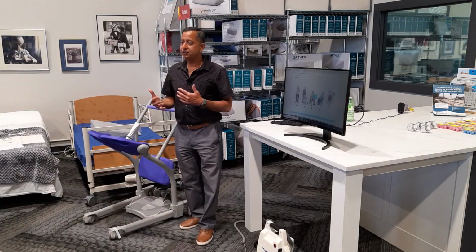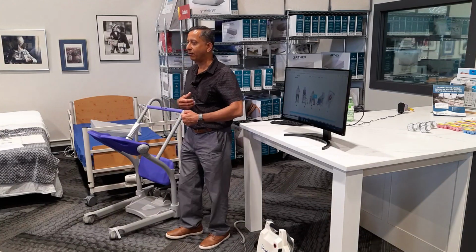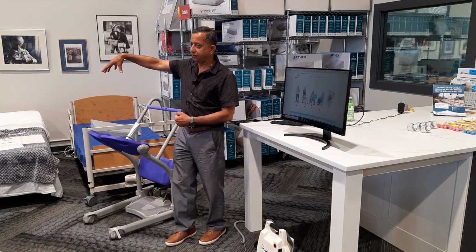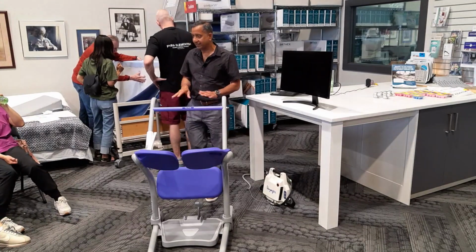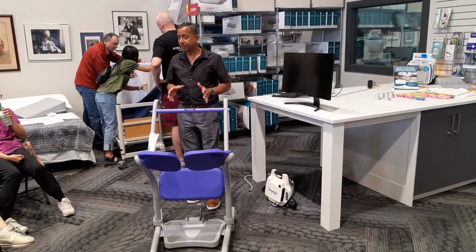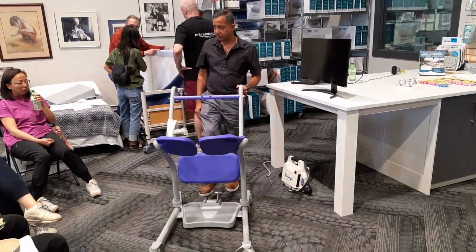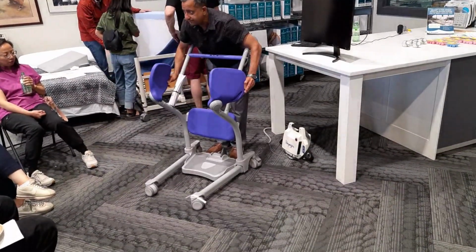So our traditional choice is to have 2 people or 1 person help Barb walk through the dining area, through the hallway, back into her room, which is basically a physical assist. This device is very simple to use. There's no electronics or motor or anything involved in it. It's a simple mechanical device. The way it works, you open the base, close the base. These 2 pieces pull apart.